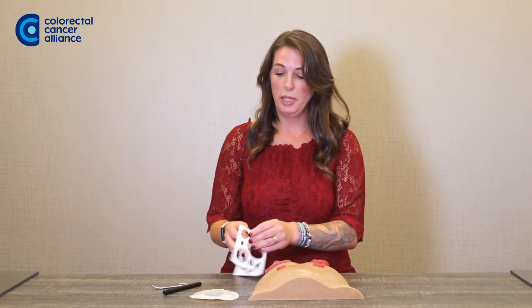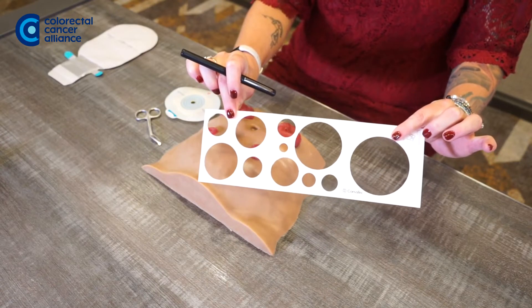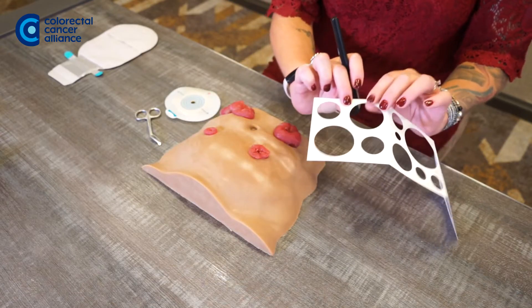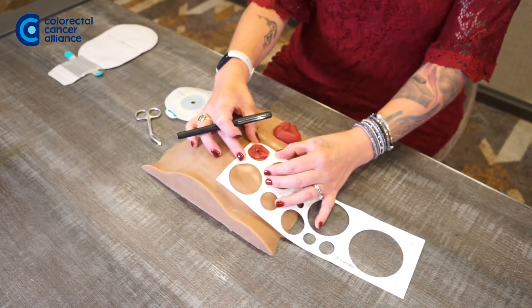So you really want to make sure you're getting a close cut. What each manufacturer has done is include stencils in all of the ostomy bags. What you want to do is try and fit the stencil closest to your stoma.